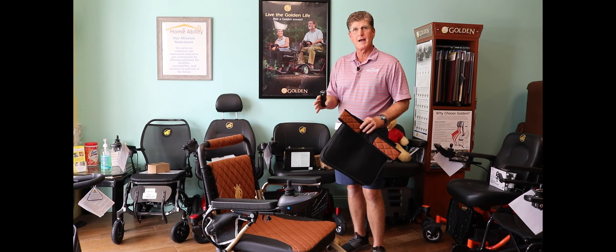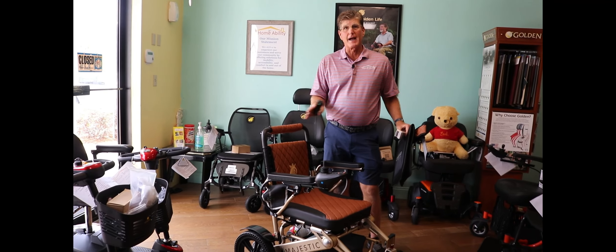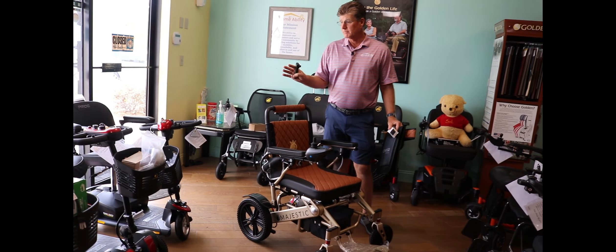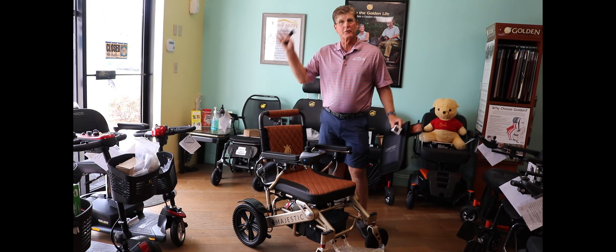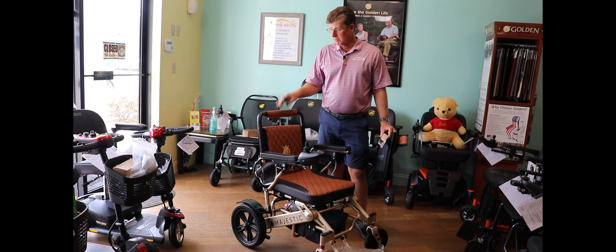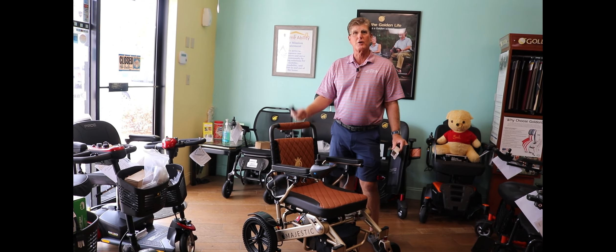If you want to try it out, we are the only ones around that are going to have this chair — for at least the next few years, who knows. We're proud to carry it and excited about it. Come into the store and try it out.